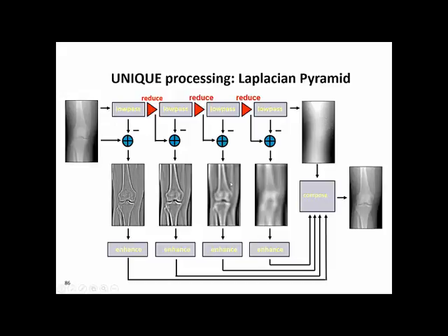And afterwards we compose all these partial pictures together to have the final image that is going to be sent to PACS, and that's displayed on the local monitor. The user interface implementation is much more simple than this picture implies. In our user interface we don't show all these technical parameters. This is one of the big benefits of unique image processing compared to others.